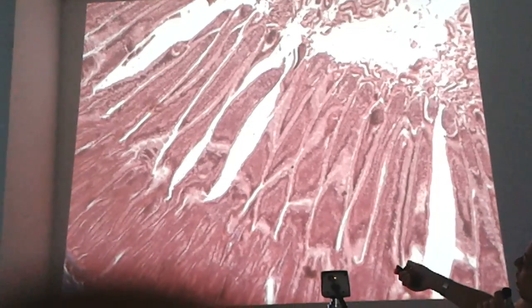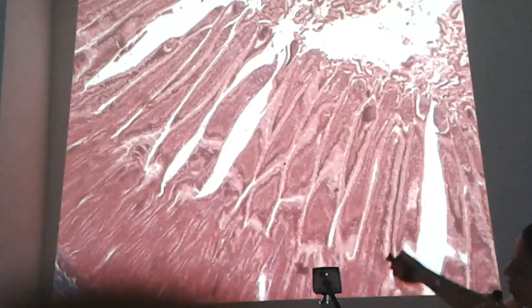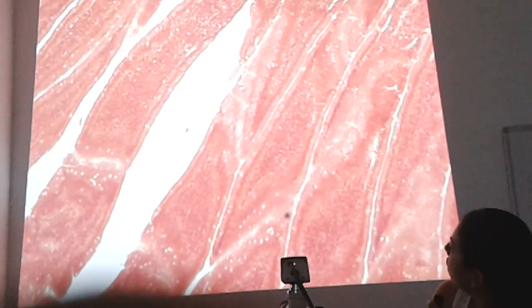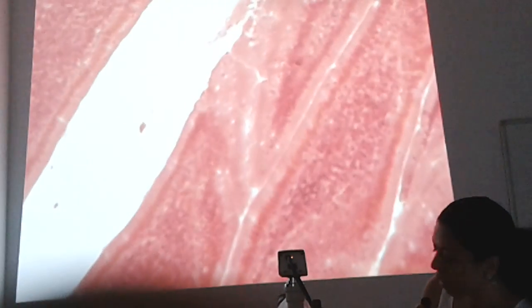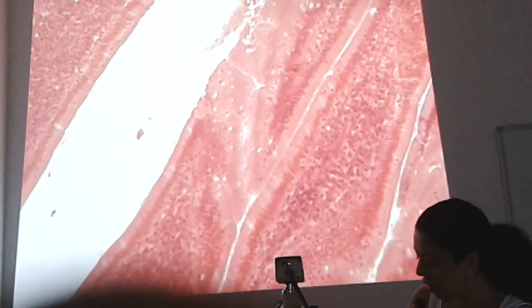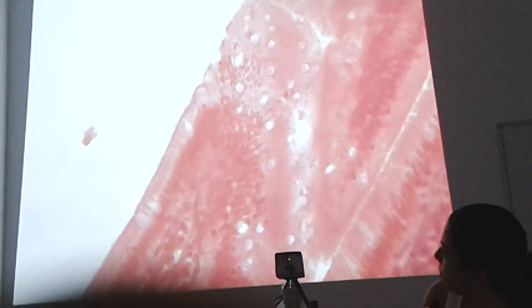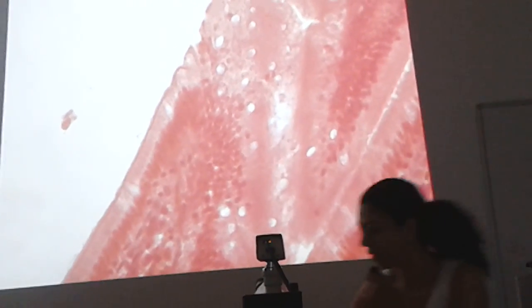The epithelium lines these villus structures. These are the epithelium. So I'm magnifying the image to see the epithelium more clearly. I magnify more. Maybe one more.